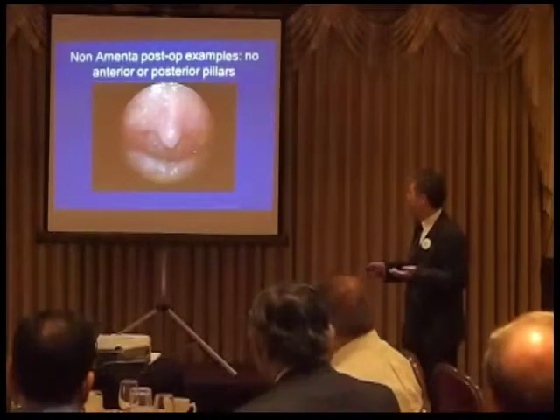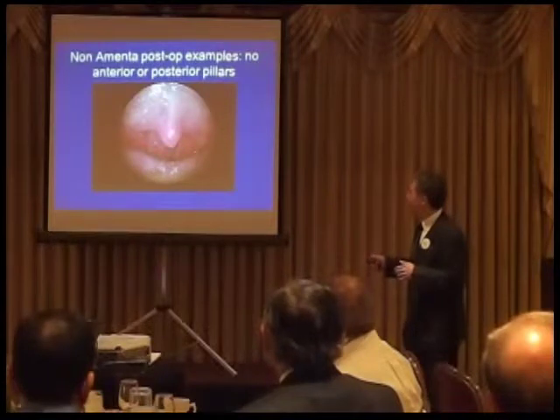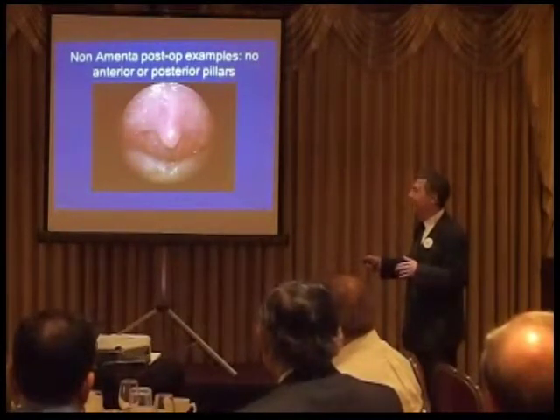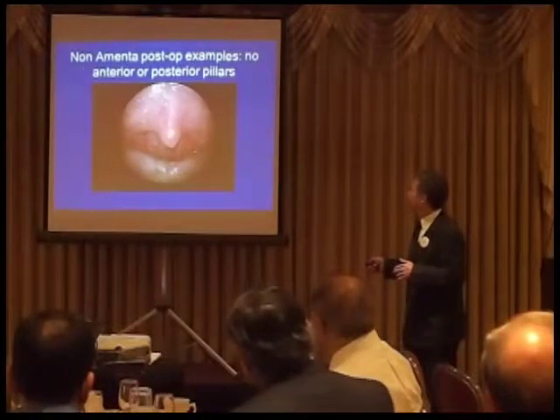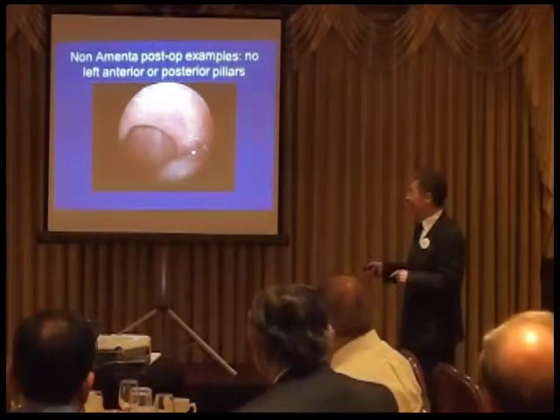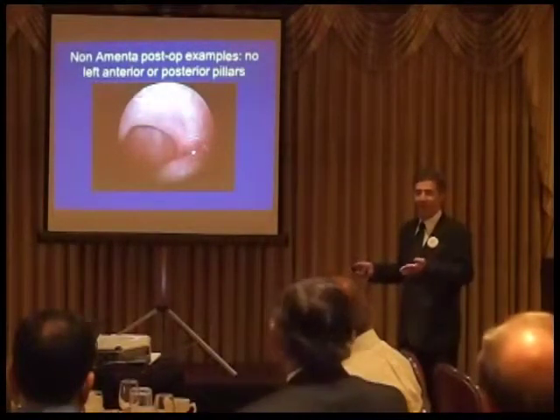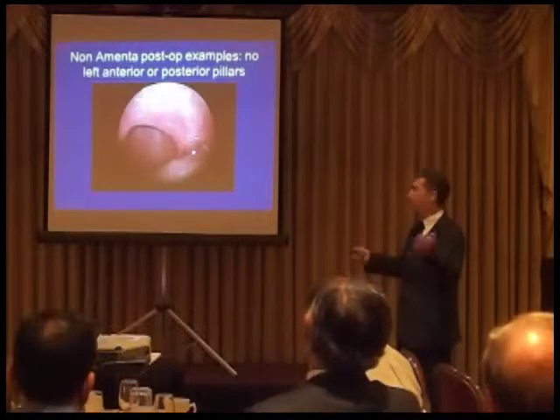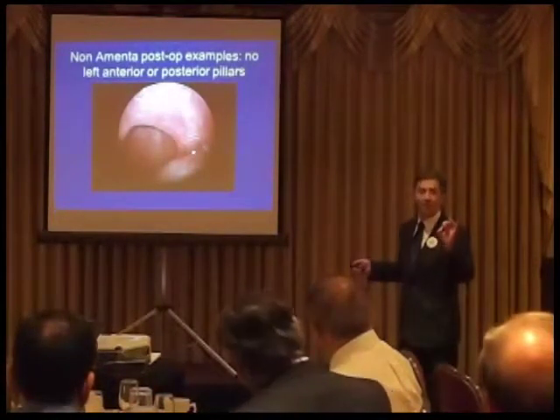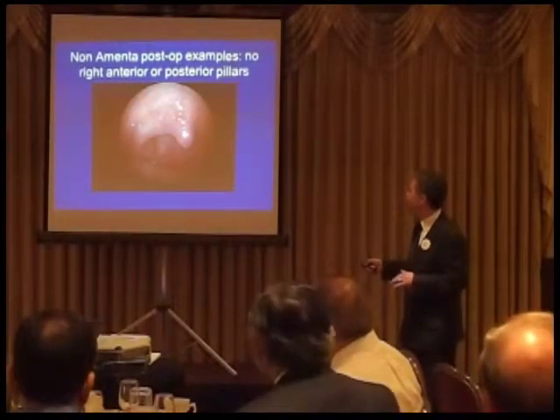Here's another patient. These are, like I said, literally patients that came into my office last week. And you can see there's just not much there. Her palate scarred right into her fauces. Now, there's such a thing as uvulopalatoplasty. I had a patient today, so I put that picture on here too. So I was thinking to myself, it's not like it's terrible if you cut off the anterior pillar. It's like you're giving them a uvulopalatoplasty and opening up their airway for no extra cost. But when it comes to pain, though, there is a cost, if they expect a low pain tonsillectomy.